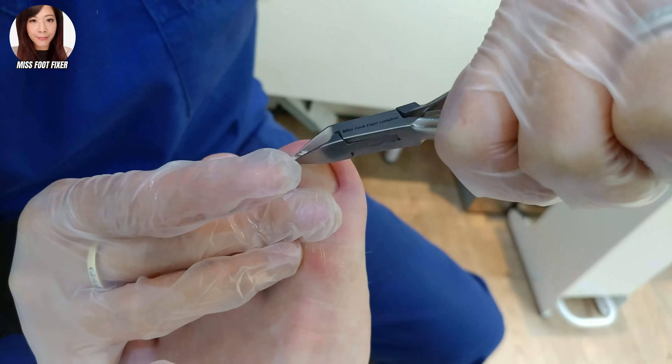It looks like a perfectly good toenail now. So what we're going to do is cut it straight across like that — make sure there's just a little bit, quick, straight across — and maybe take off this dead skin here, because sometimes this can cause ingrowness.